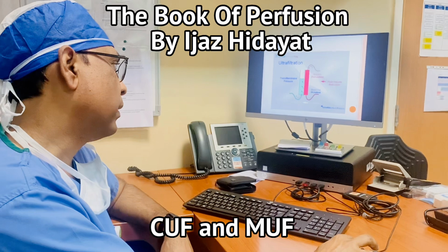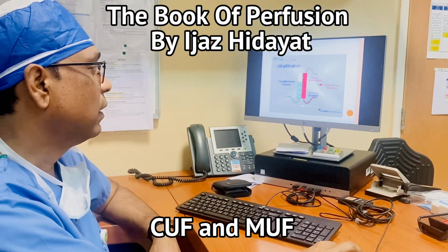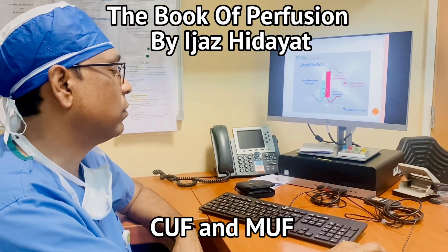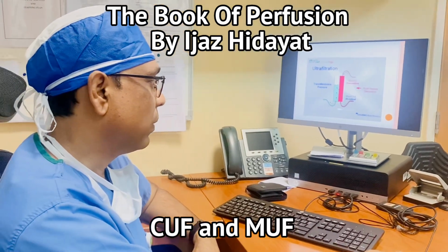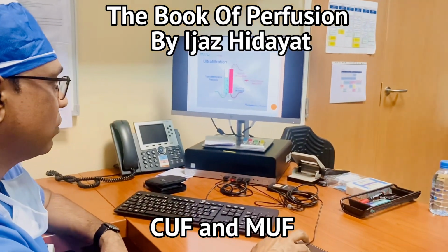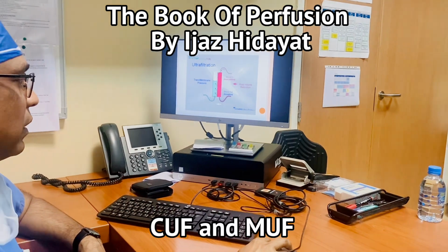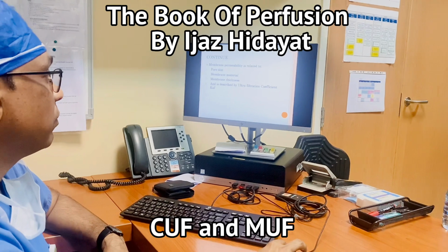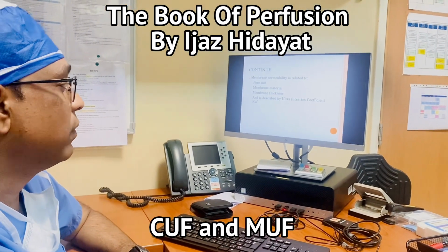When we create a transmembrane pressure of about 400 to 500, the rate of ultrafiltration will be higher. The low solutes and the plasma water will come out from higher concentration to lower concentration, and this is the mechanism during the process of ultrafiltration.